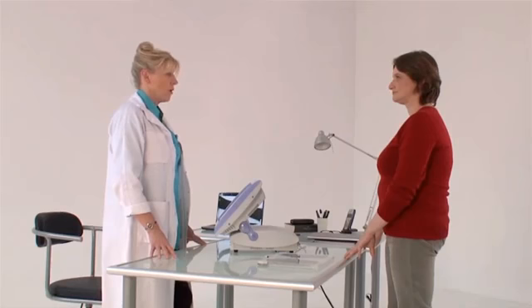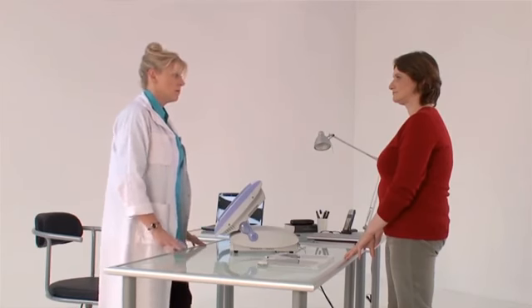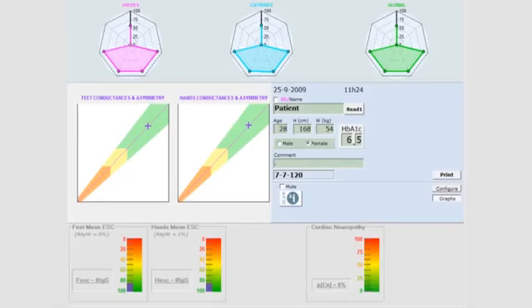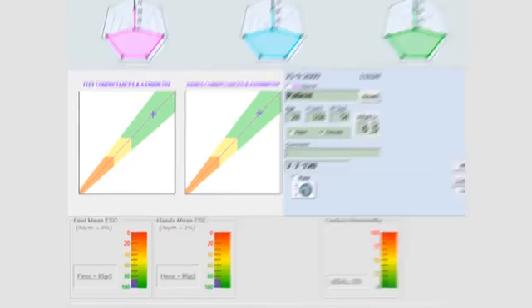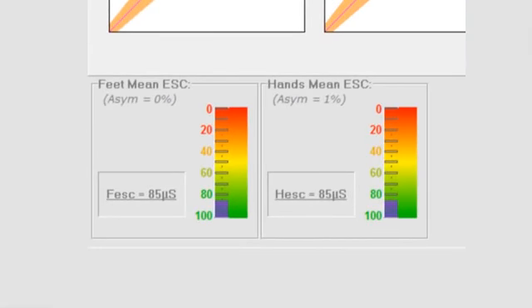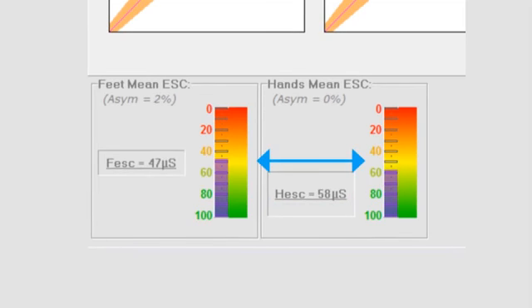A double beep indicates that the scan is complete. The patient's report is automatically generated. The measured conductances are expressed in microsiemens. A conductance of greater than or equal to 60 microsiemens indicates good sweat function. A conductance between 40 and 60 microsiemens indicates moderate sweat function and suggests possible early signs of peripheral autonomic neuropathy.